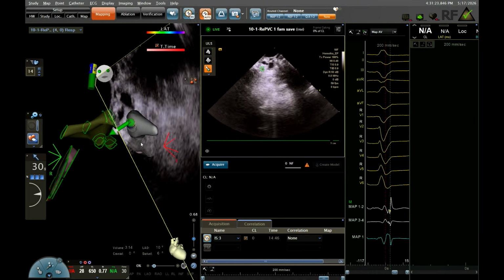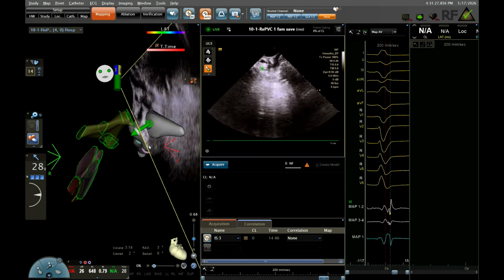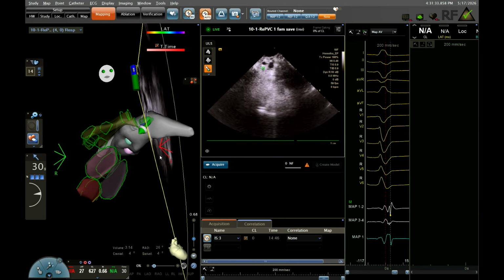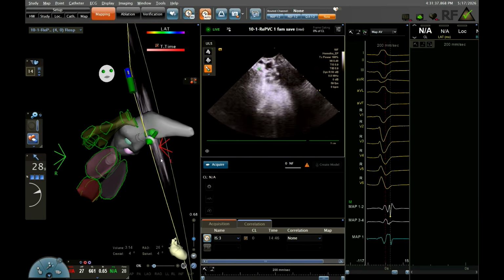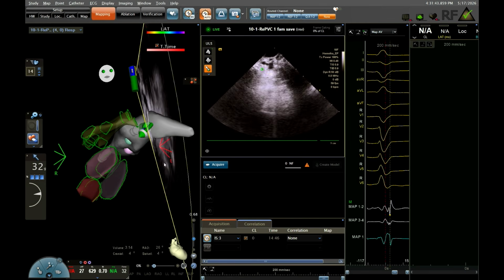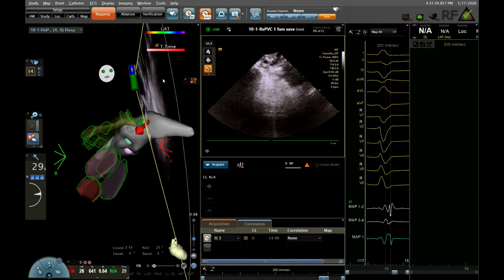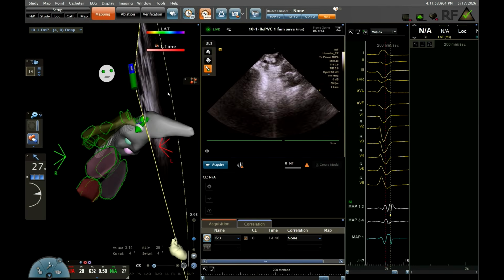Stop when you have the PVCs, and let's show it. If not, we have it recorded. You can show from the beginning, but we're hoping to have some PVCs here live. If not, you can show from the beginning when we said it was late. Because here, the activation is late. You have a low type of EGM. It's hard to capture. And the activation was late for both PVCs. So you can put the prior map up with the color. She's not having many PVCs right now, but we will wait for them to come back.